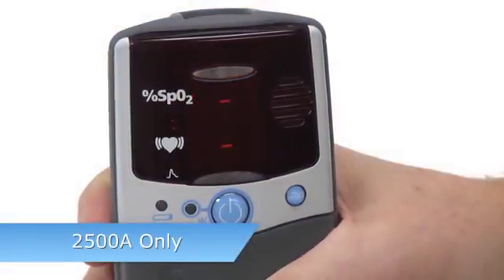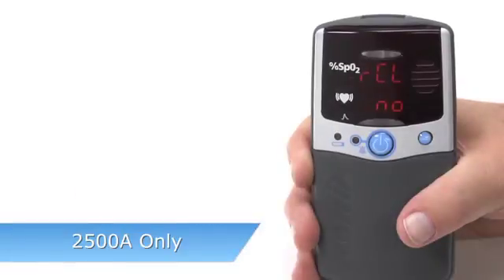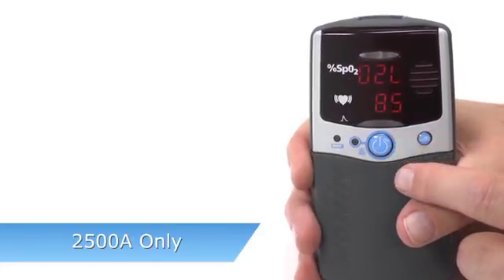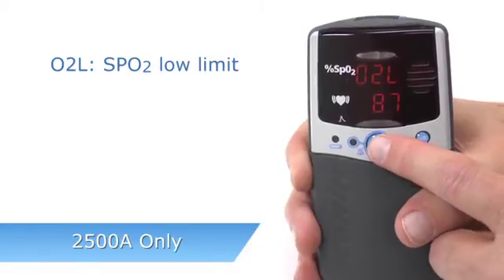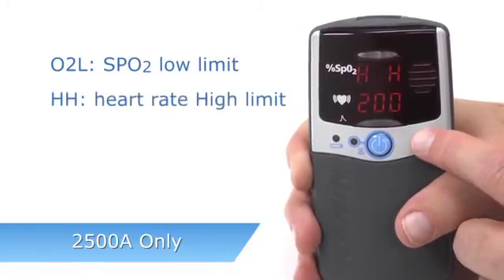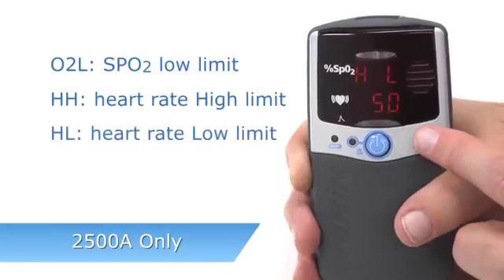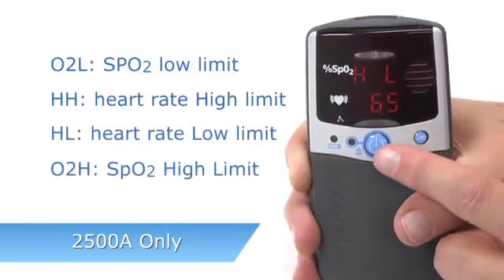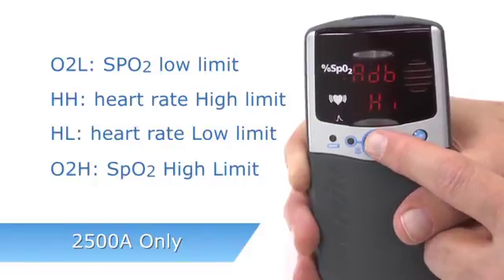If you retain the settings, you will automatically exit Setup Mode. If you clear custom alarm settings, you can scroll through and reset all values on the oximeter. O2L is the SpO2 low limit, HH is heart rate high, HL is heart rate low, and O2H is SpO2 high, appearing in that order.